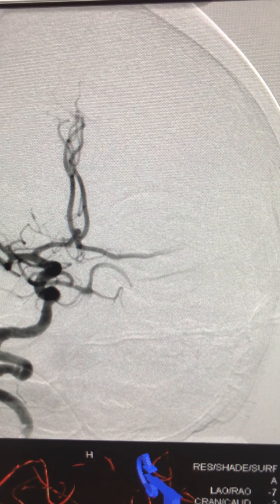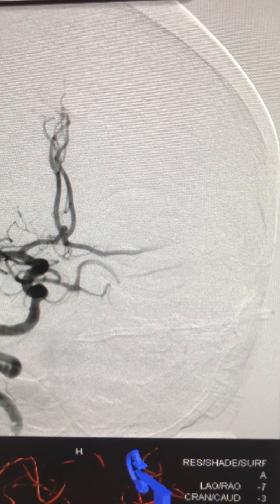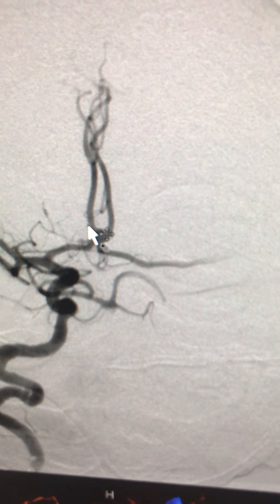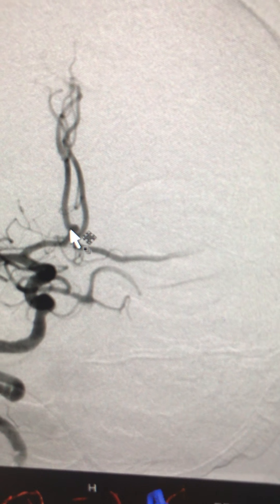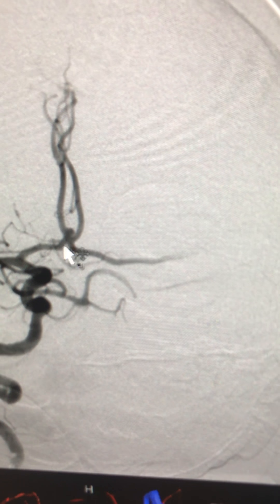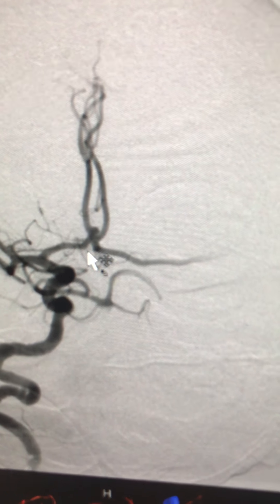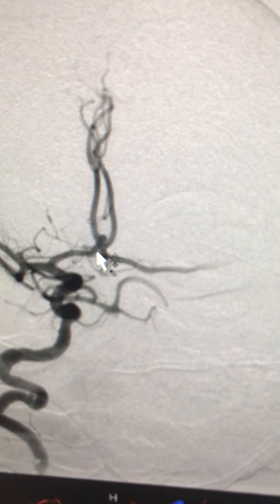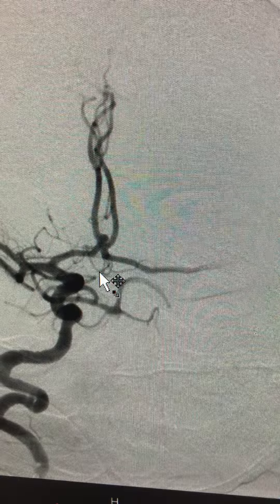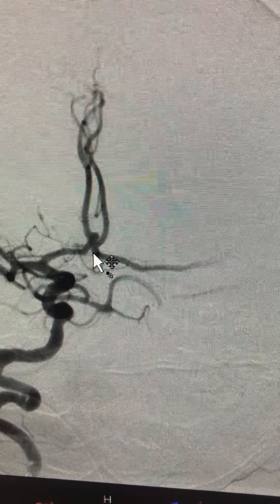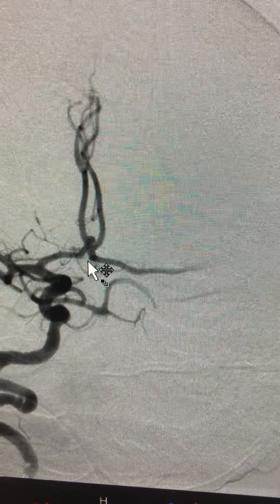Initially I started by trying simple coiling, as sometimes the anatomy turns out to be easier than expected — but not in this case. I tried to place the tip of my catheter inside the sac of the aneurysm — here is my catheter in the sac — but I was not able to place the coil to stay within it. I then tried to cross and place a stent from A1 to A2 from the right side, but the anatomy and the very shallow, small aneurysm made it difficult. I was also concerned that my catheter and wire kept going into the sac of this recently ruptured aneurysm.